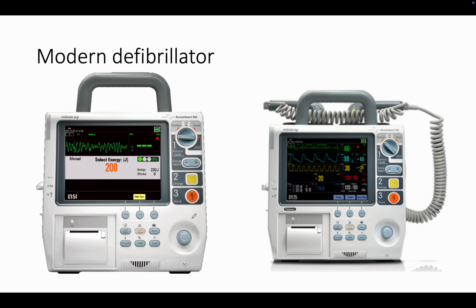This is the modern defibrillator, which has a pacer in it, also an AED, a manual defibrillator, and there is electrical energy also. We can choose the joules, and we can also monitor the cardiac rhythm here.